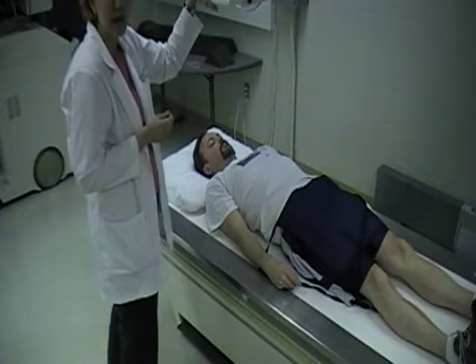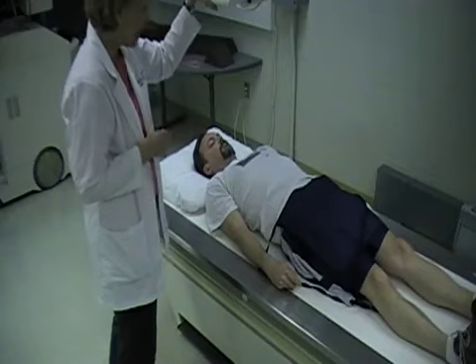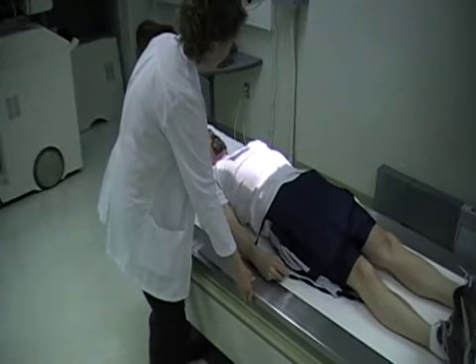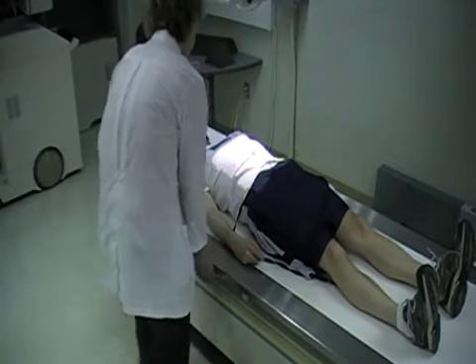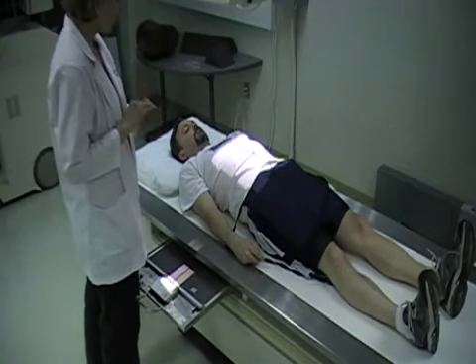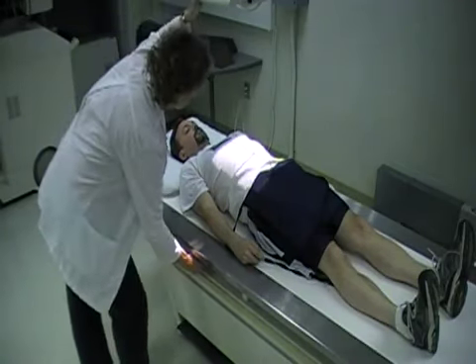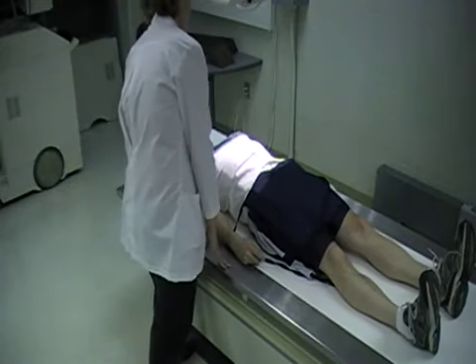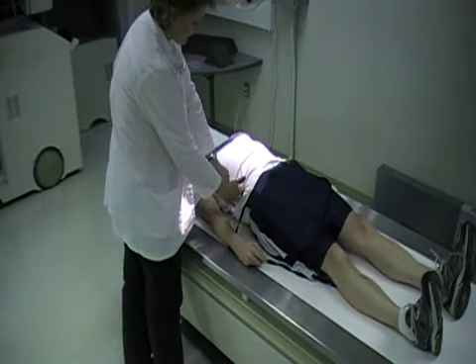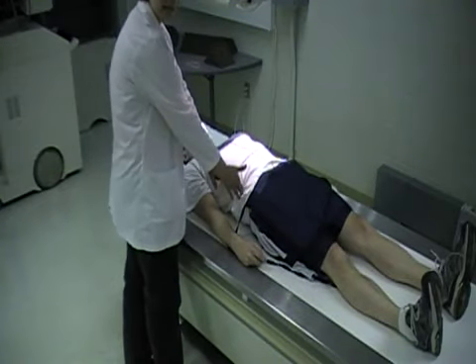If he or she does want some overhead images, there are several images that they may ask for. So on our AP image or projection for the stomach, you can either use a 14 by 17 image receptor, or you can use the 11 by 14 image receptor. I've got the 14 by 17 in here, and you can palpate the very bottom of the rib cage, and then your transverse line is going to cut right across 1 inch to 2 inches above that.